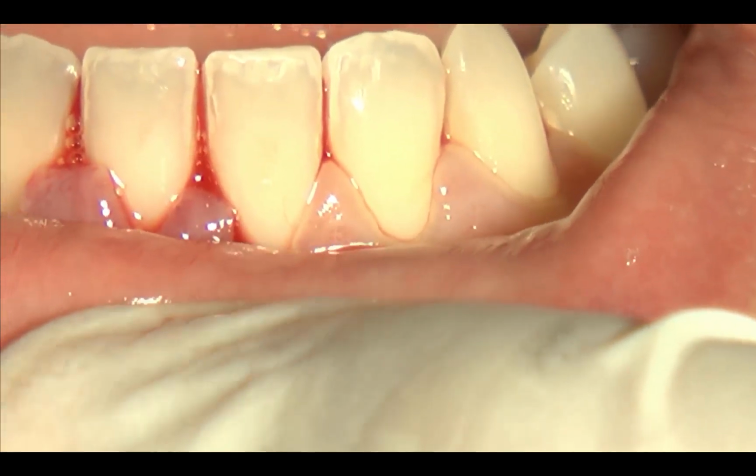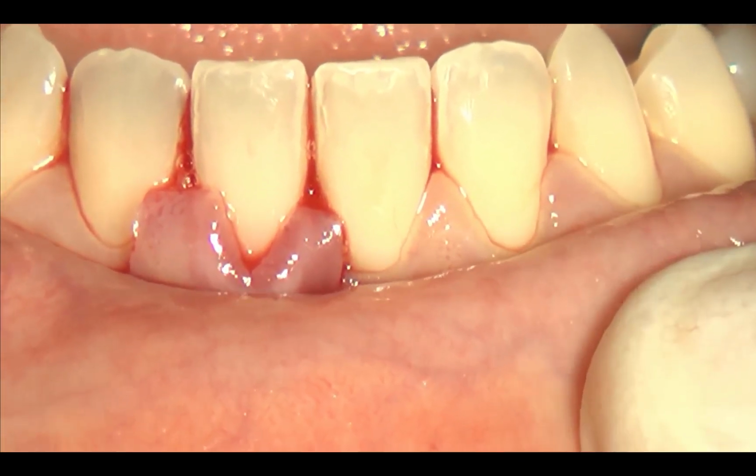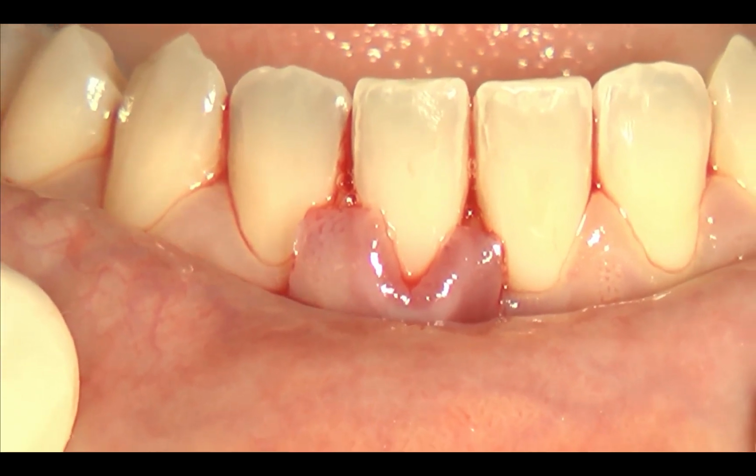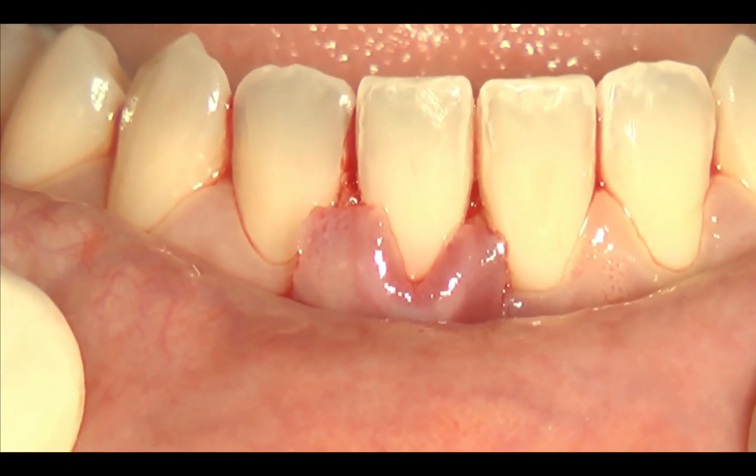And in this position you keep the lip in order to maintain the papilla in the final position. This is very important. And now we make a stabilizing suture.